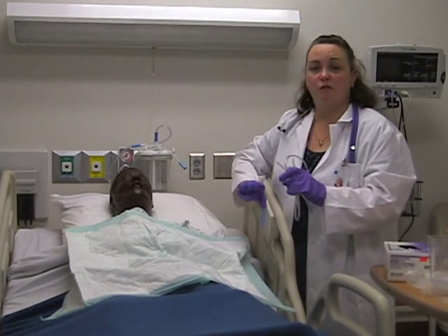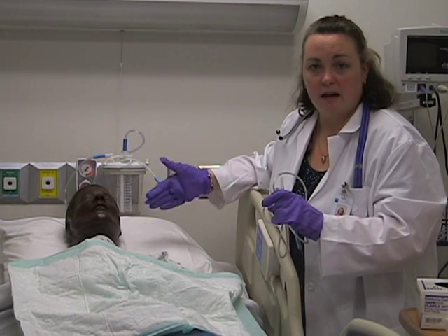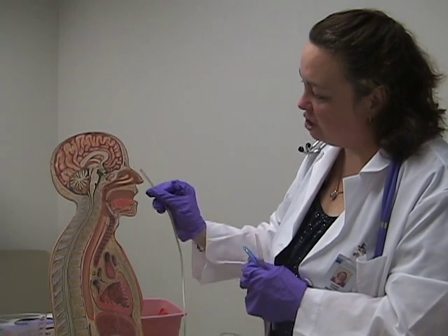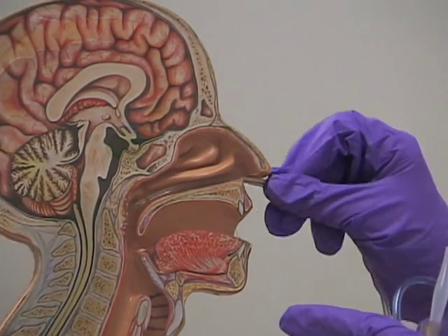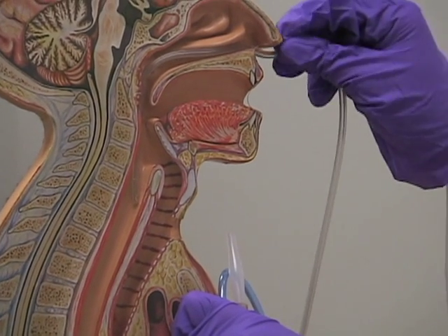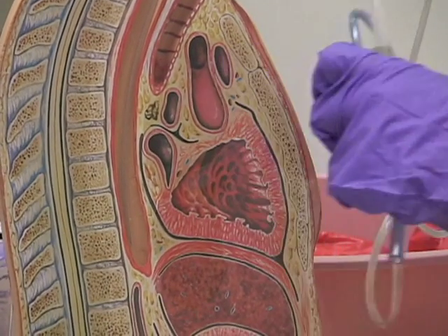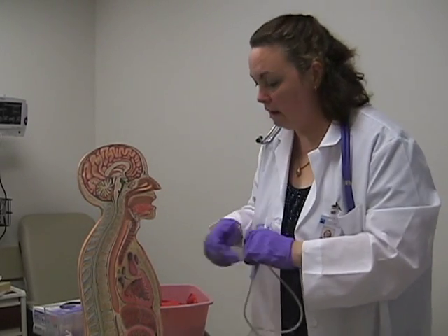With the patient ready, the first step is to have them hyperextend their neck. Remove the pillow so they can extend the neck in a more comfortable position. A common misconception is that when inserting the NG tube you should aim upward, but if you look at the anatomy, you should actually aim downward — the tube will go through the back of the pharynx and into the esophagus. You do need to rotate to get it to insert, and when going into the patient, aim down and toward the ear, which will make insertion easier.